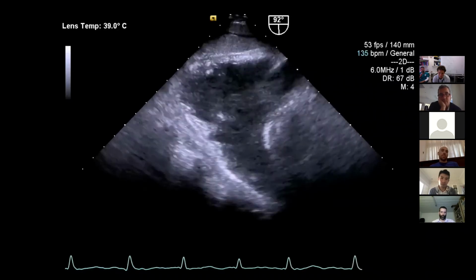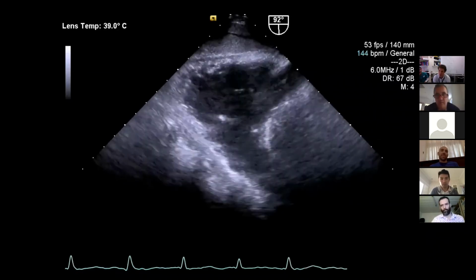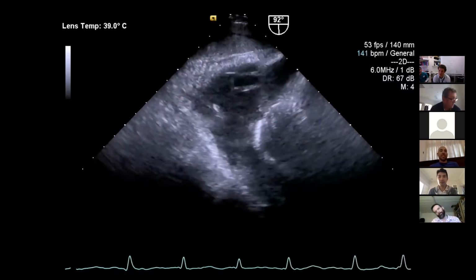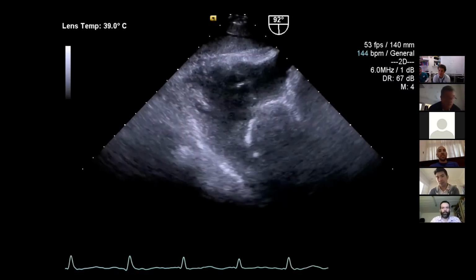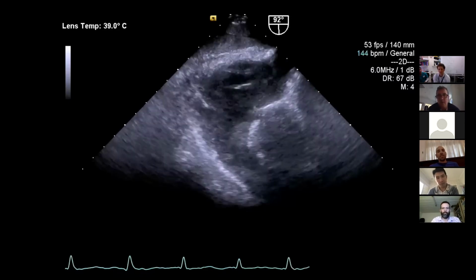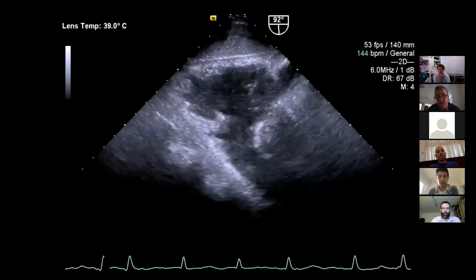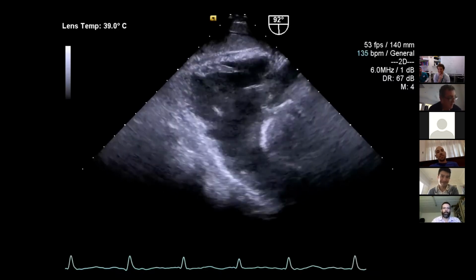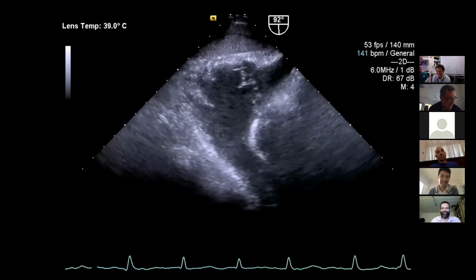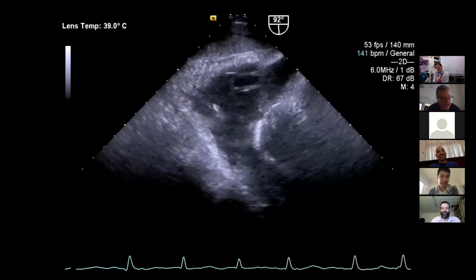Bicaval? Nope. Sort of an inflow-outflow, is it? Nice. Of what? It looks like a bicaval of sorts, except the rotation is funny. It's not a bicaval, so it's inflow, outflow of something then. I'm still in the gastric view, and I just went up to 90 degrees.